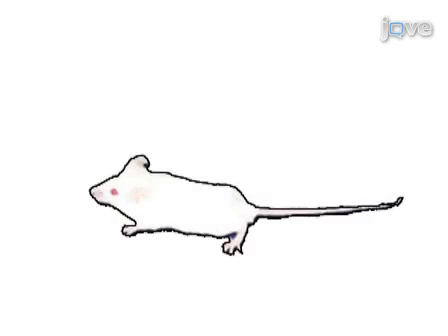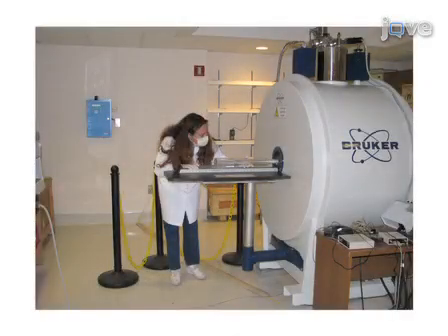The affected brain regions are visualized before and after injection of virus-infected monocyte-derived macrophages. The second step of the procedure is to image brain subregions containing cell-laden magnetically labeled or therapeutic nanoparticles. This is done at various times after the injections of cells containing magnetically labeled nanoparticles or nanoformulated drugs.